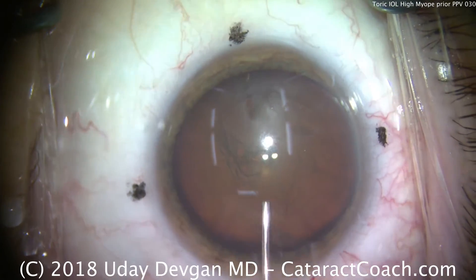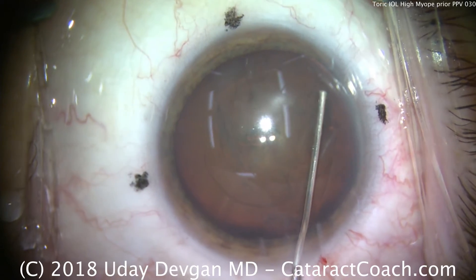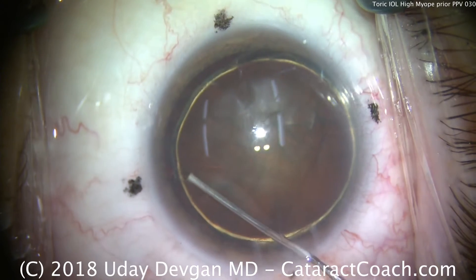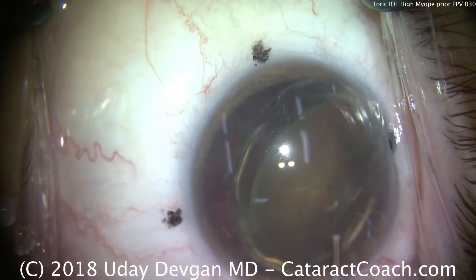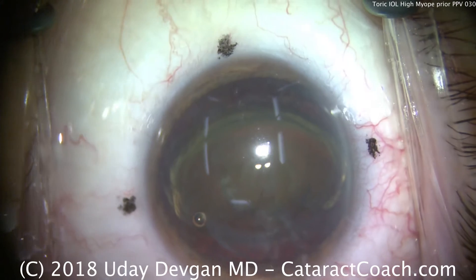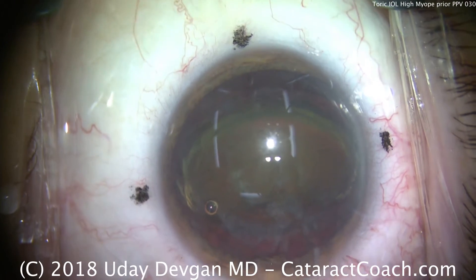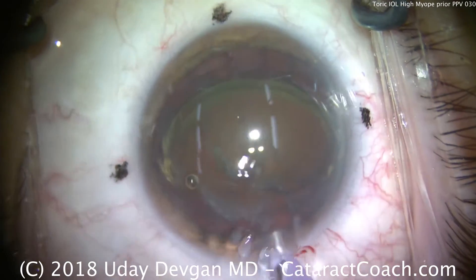A little hydrodissection and some hydrodelineation are performed. The challenge in a very myopic eye — and also in a vitrectomized eye, and this eye has both — is that the anterior chamber can become overly deep. By prolapsing the nucleus out of the capsular bag, and with a deep AC there's plenty of room, we're going to have an easier time accessing the nucleus for removal.